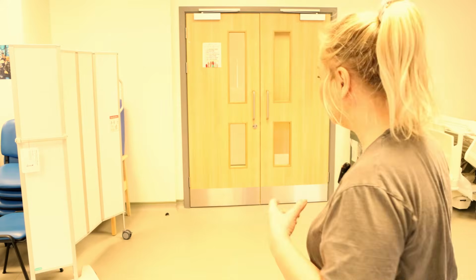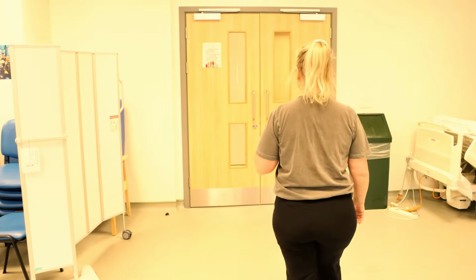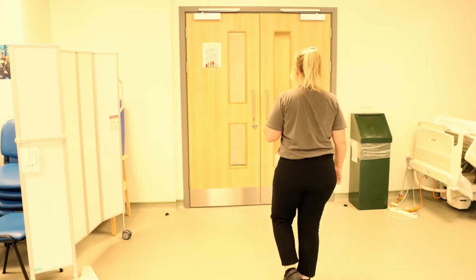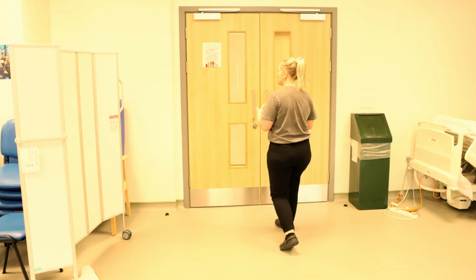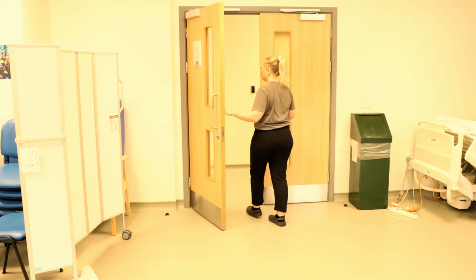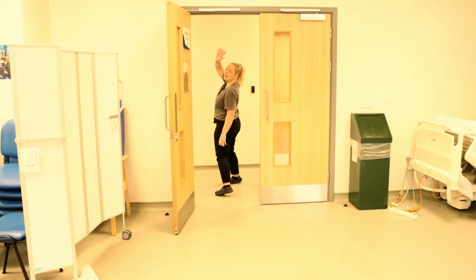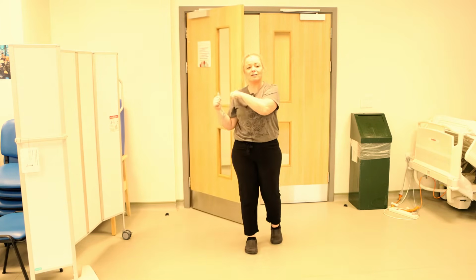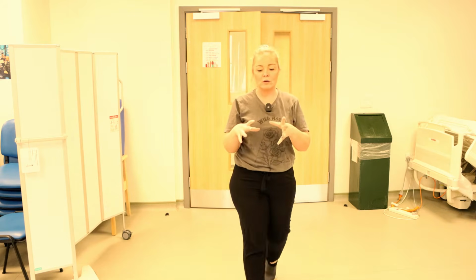What you want to do is this. Nice and slow. 1, 2, 3. Release. I'm going to try and come back in a little bit. 2, 2, 3. The fluid's going to try and draw back into the lungs. By the time I get to the 3rd or the 4th breath, I'm gone. Bye. I'm out of the lungs, and that's what we want. We want to get out of the lungs so then we can aerate the lungs with some oxygen.